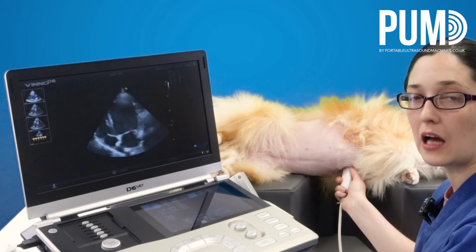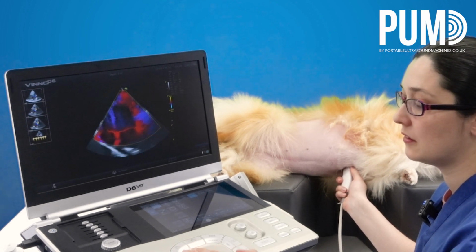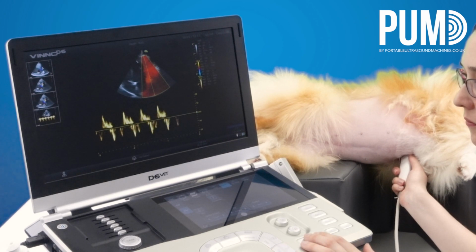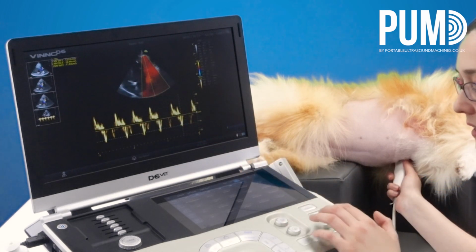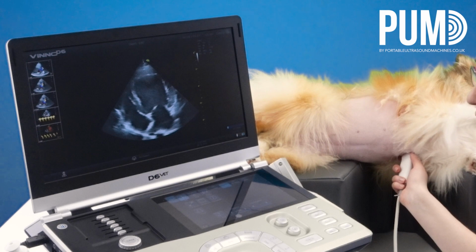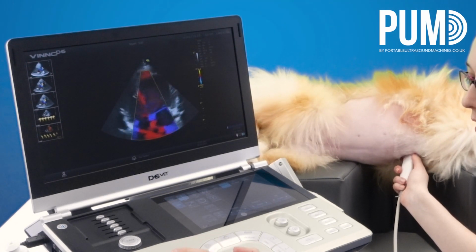From the left side now, if I wanted to look at diastolic function, I have tissue Doppler, which I can place. So I've got her lateral E prime readings up here. I'm going to save that. And then of course I can just do the same on the septal side. It should be a little bit lower.